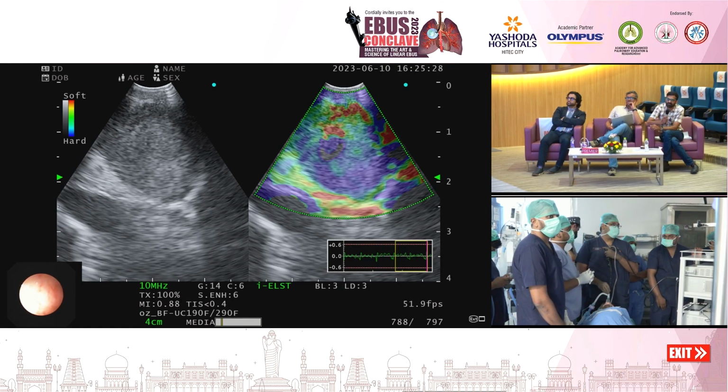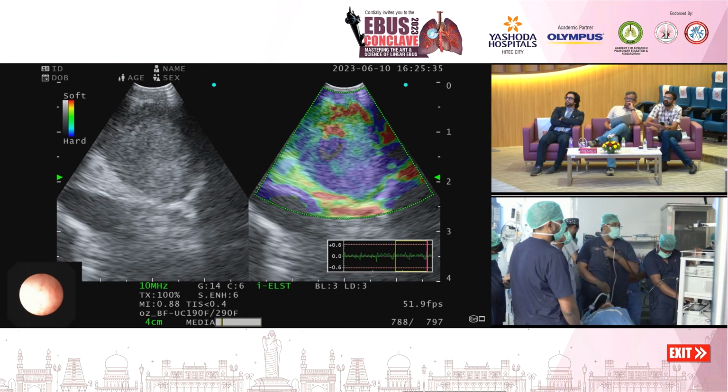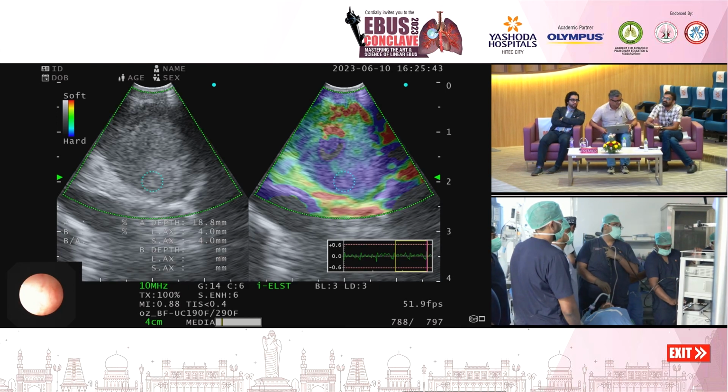Semi-quantitative methods? So basically we have what we call a strain ratio and strain histogram. For the strain ratio, we select two areas, A and B. The area A is usually the hardest part. You select a hard area within the node.